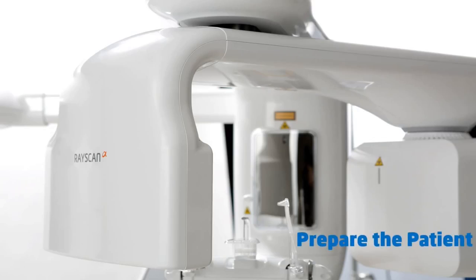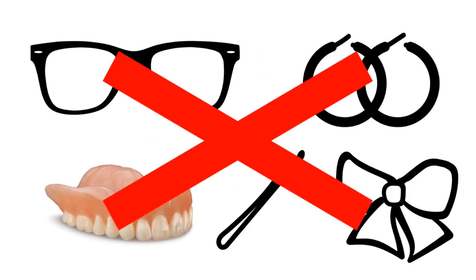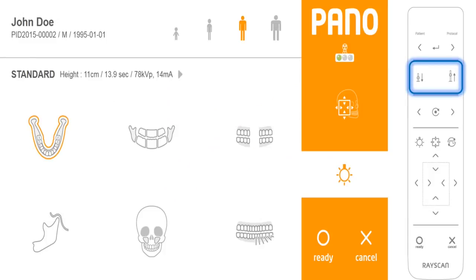Prepare the patient. Ask the patient to remove glasses, dentures, jewelry, hair clips, and pins. Place the protective lead apron over the patient's shoulders.